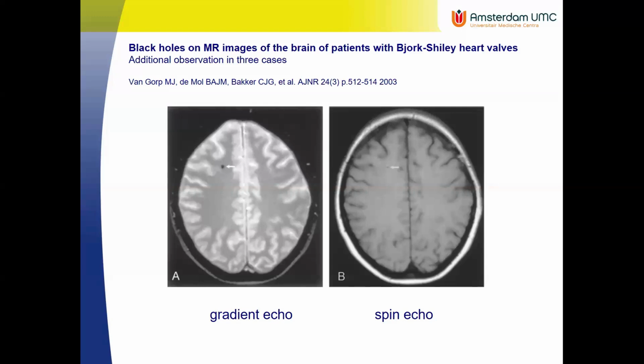Now you could probably not guess what happened there, but it was really weird that all these patients had a certain type of heart valve. And the heart valve actually also contains metal. Apparently the construction of that heart valve was a bit weak, because you have the blades of the heart valve, the mechanical motion happening all the time, and apparently the metal got tired and broke off.